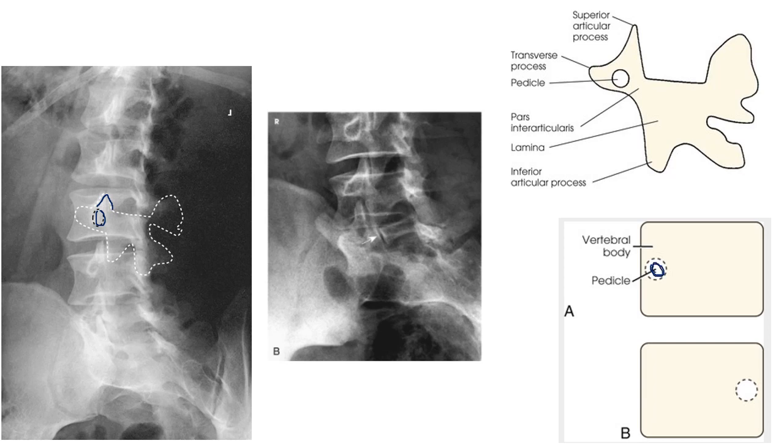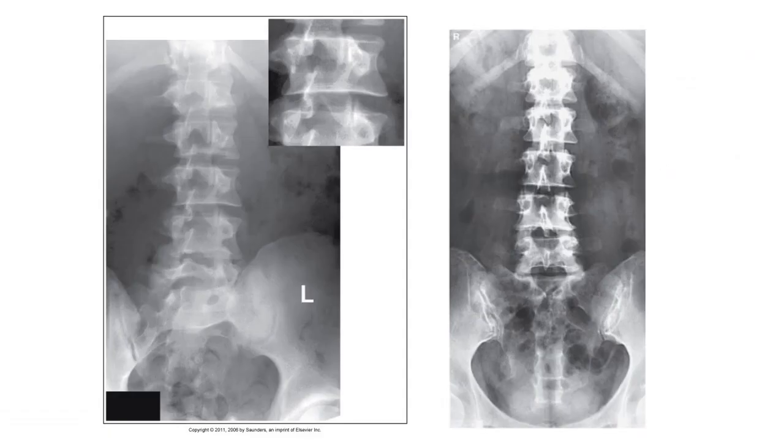was not enough rotation. And that's exactly what we see here. So the image that we're showing on the left-hand side is an LPO. How we know that is the Scotty dogs are facing to the left. The ilia or the ala is very flat on the left side. And third, the right SI joint is visualized. It's crunched. So we're looking at an LPO position.